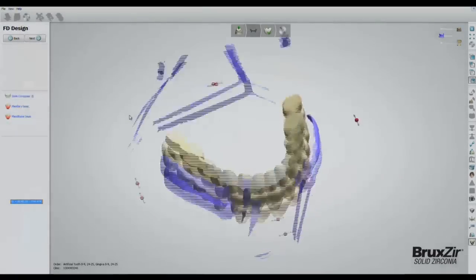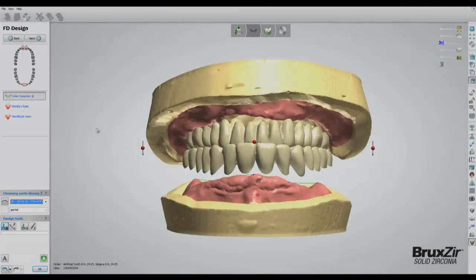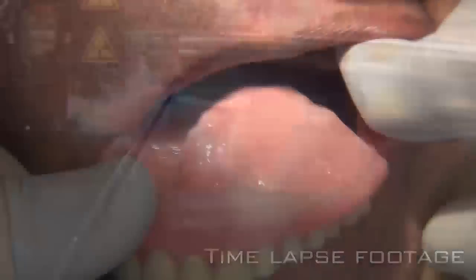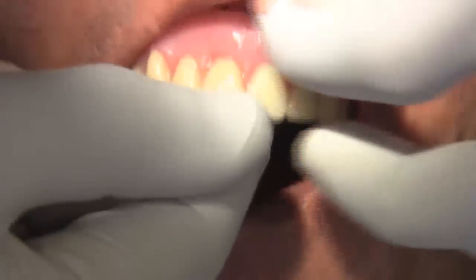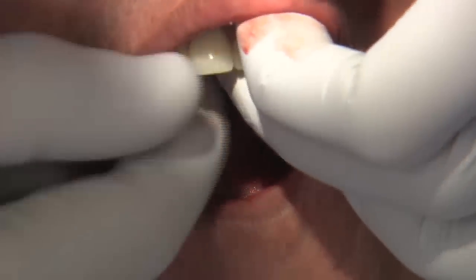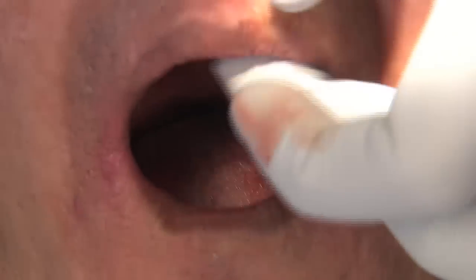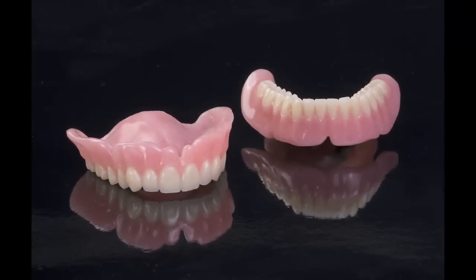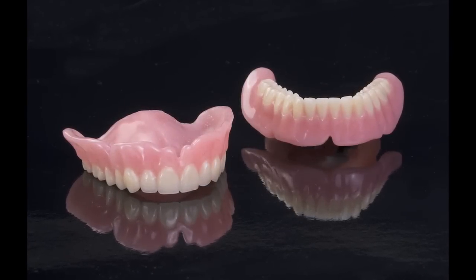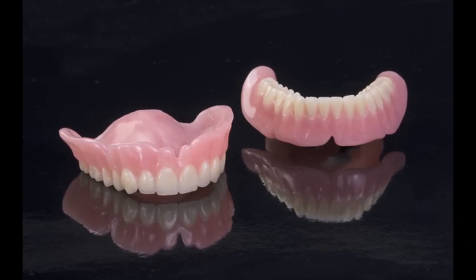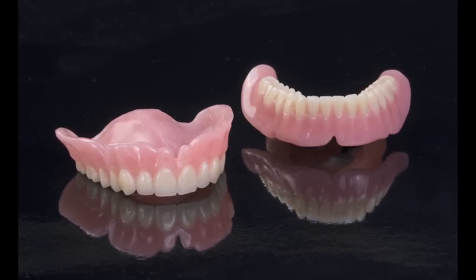Fabricating dentures with CAD-CAM design and 3D printing saves you time, money, and resources, and can help you experience smoother try-in and delivery appointments. Let's take a look at the fabrication process for CAD-CAM dentures.